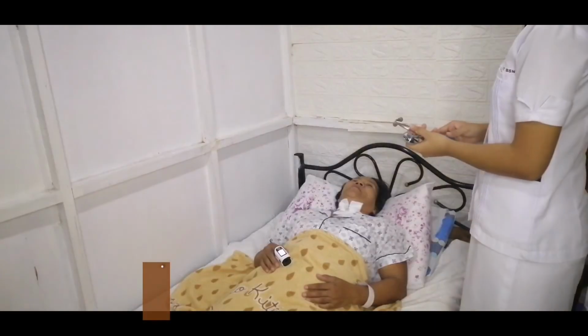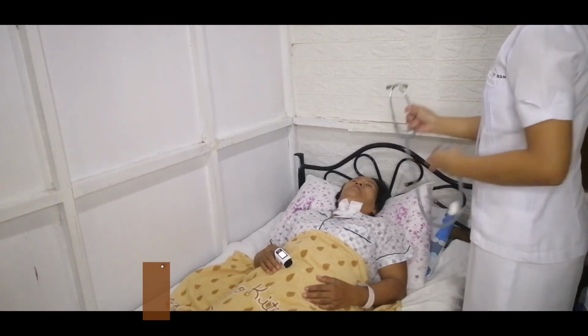Lastly, we assess the patient's respiratory status, including the respiratory rate, effort, oxygen saturation, and lung sounds. Check ko lang po ulit yung lung sounds nyo.